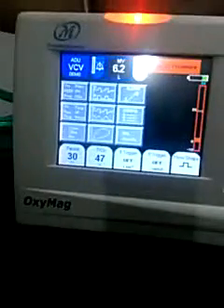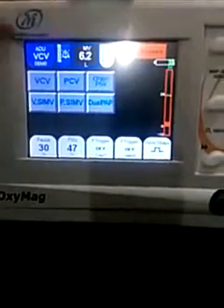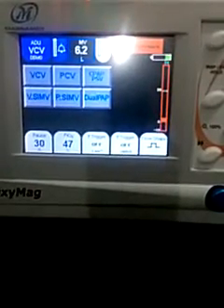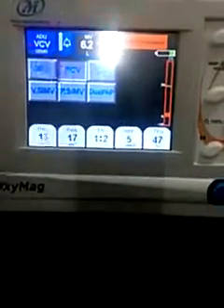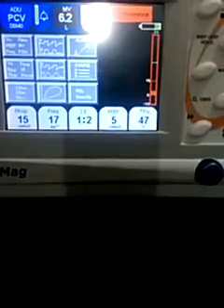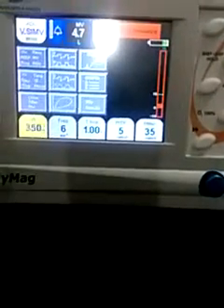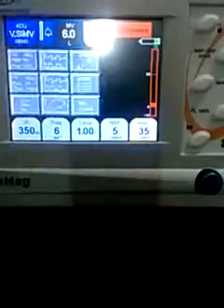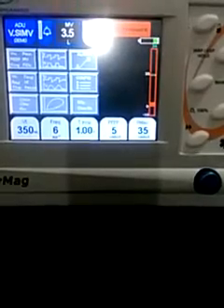Then you confirm. To change the mode, you just press on the mode here, and then you will see all modes available for this patient. So go from VCV to PCV, and then confirm. Now we are in PCV mode. We want to go to SIMV volume. We need to confirm this and confirm the pressure max. Now we are in SIMV volume.